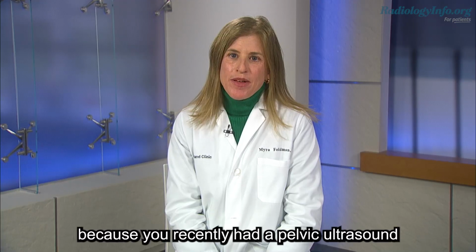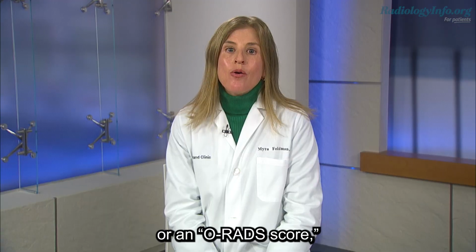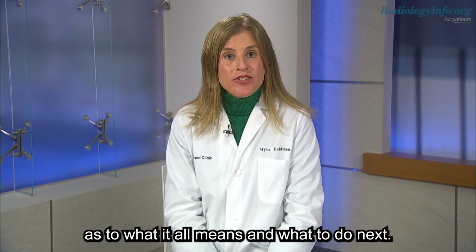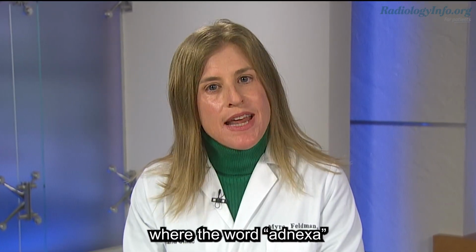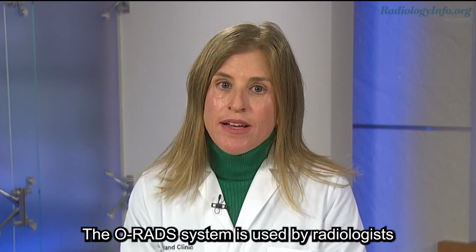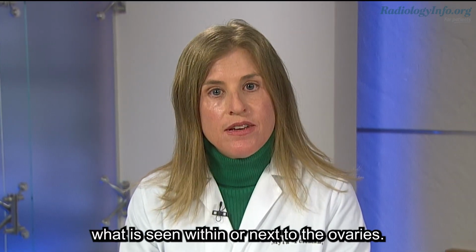You are likely here because you recently had a pelvic ultrasound or pelvic MRI, and the report included the word O-RADS or an O-RADS score, and you have questions as to what it all means and what to do next. O-RADS stands for Ovarian and Adnexal Reporting and Data System, where the word adnexa means the area around the ovaries. The O-RADS system is used by radiologists and gynecologists to report what is seen within or next to the ovaries.